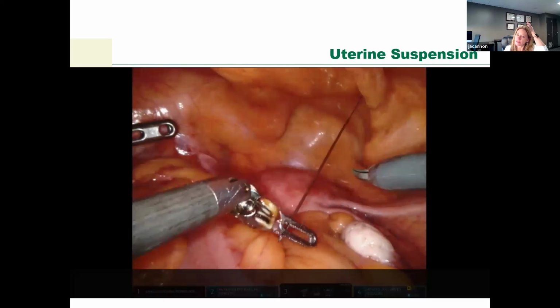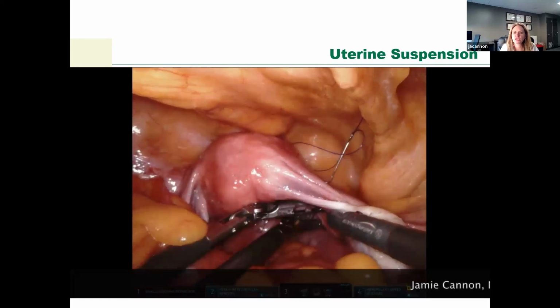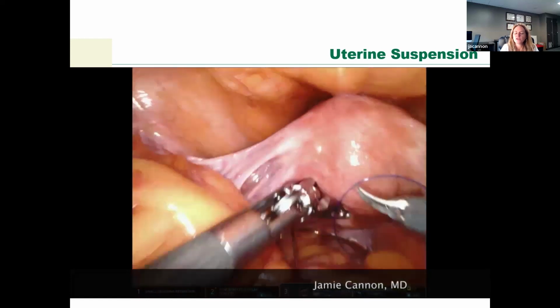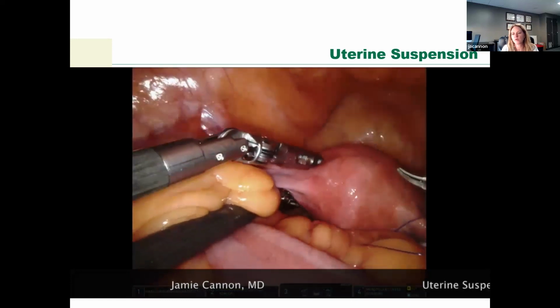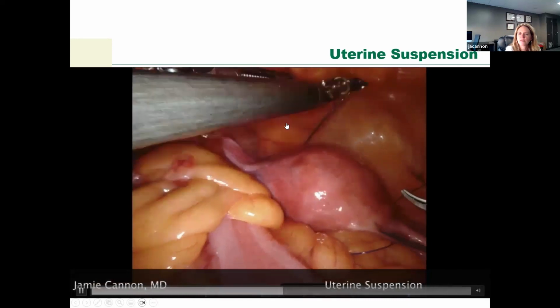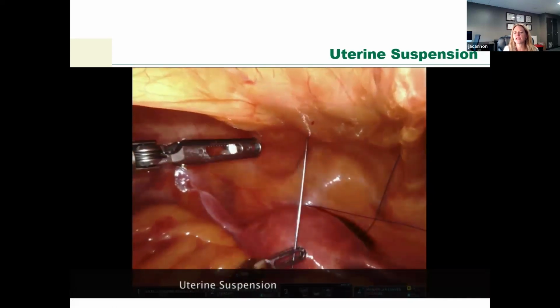Just some things. So in women, obviously, unfortunately, the uterus frequently gets in the way, and this is just demonstrating our technique for managing a uterus that is floppy and kind of laying in our way. You can see we bring a Keith needle from the suprapubic region. Bedside assistant will bring that in place, and then I bring it through the broad ligament on the right side of the uterus, and then underneath the uterus, and then up through the broad ligament on the left side. So it's not going through the body of the uterus; it's going through avascular planes.